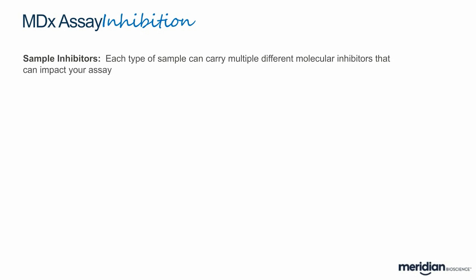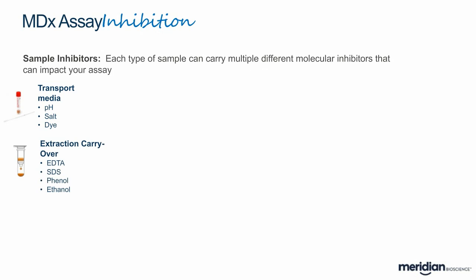The first topic I would like to expand on is assay inhibition. Each type of sample will carry its unique set of molecular inhibitors that can impact your assay. This can be anywhere from the transport media, the extraction workflow, or more importantly, the sample in question. In this case, we are looking at sputum samples.